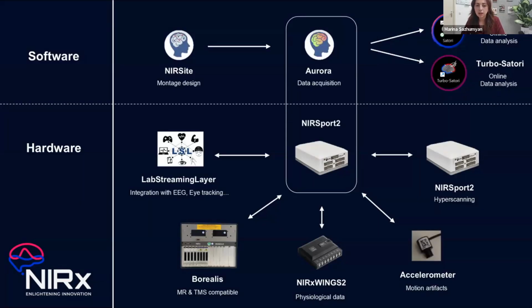So our goal is to offer integrated solutions to our users that will allow them to create their own custom montage designs and acquire the data, not only in unimodal settings, but also multimodal settings. And this is why the platform offers the NIRSite software for montage design, of course, the Aurora software for data acquisition, which not only does standard data acquisition, but now also high density dot imaging. We also provide analysis software where you can take your acquired data set to perform fNIRS analysis.